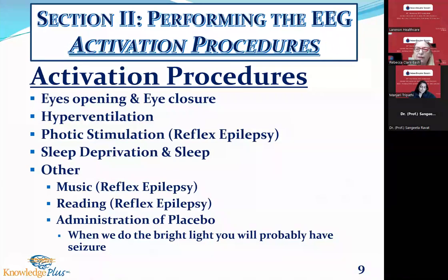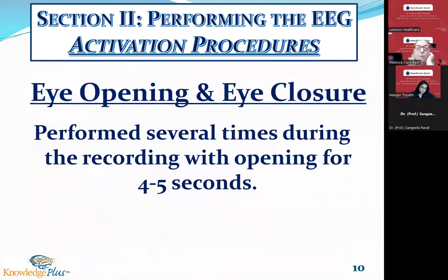So back to activation procedures: listen to the environment in which your patient has their events and try to recreate that environment. Now, with something like musicogenic epilepsy or reading epilepsy, that requires the approval order from the neurologist or referring physician, if it happens to be psychiatry where you're from. So anyway, try to recreate the environment of the patient's episode.